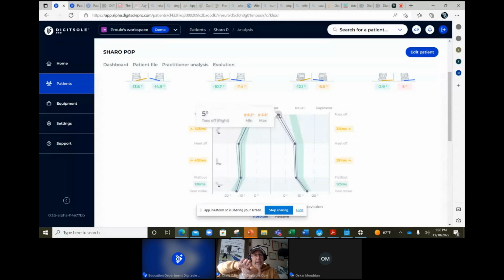If you look at the literature on that measurement, specifically related to the forefoot in pronation or supination, that's highly related to pronation. That's one of the reasons we call this the pronation supination angle. We are measuring the whole foot, so we're not technically measuring just pronation and supination, but there is a relationship to that foot position, especially when we're wearing a shoe.